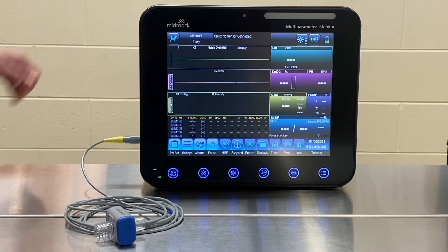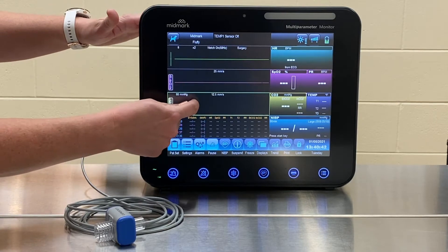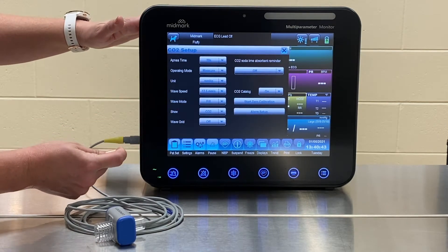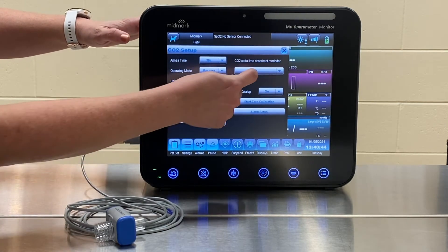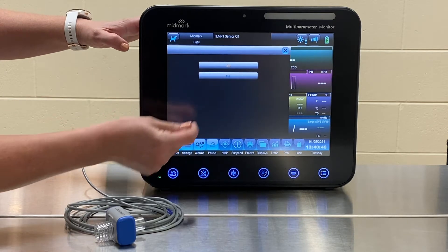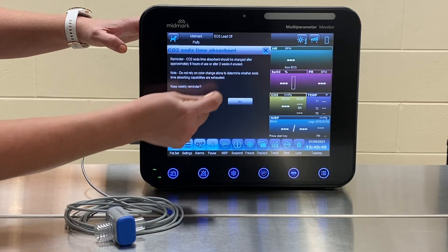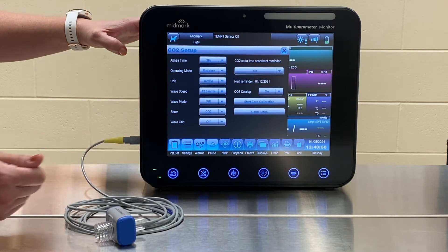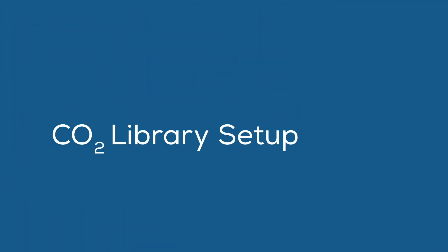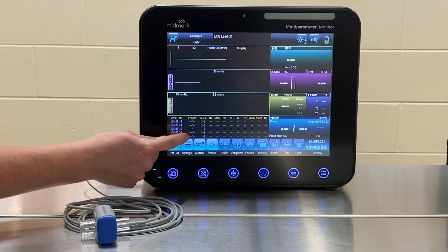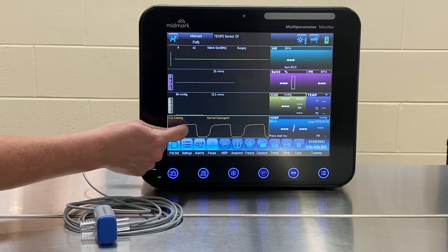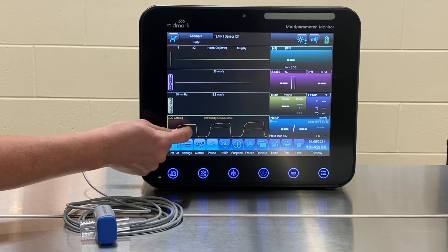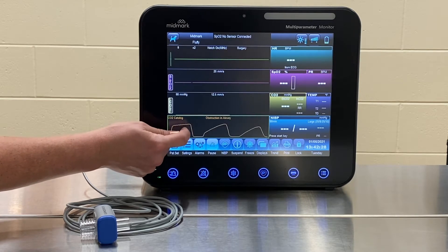To turn on the CO2 sodalime absorbent reminder, press the CO2 waveform, find CO2 sodalime absorbent reminder, and press On. To allow for weekly reminders, select Yes in the pop-up box. To view the CO2 library and quickly scroll through waveforms, select the History box.